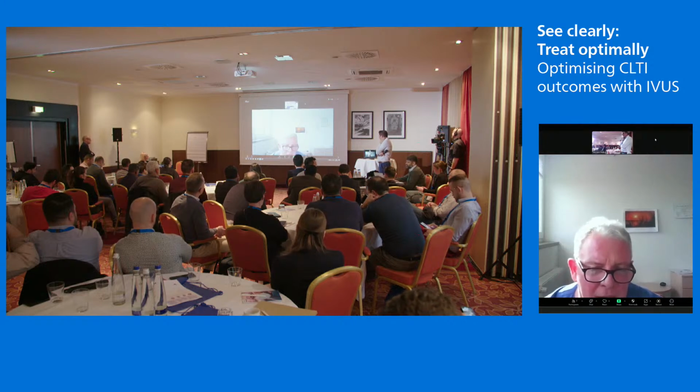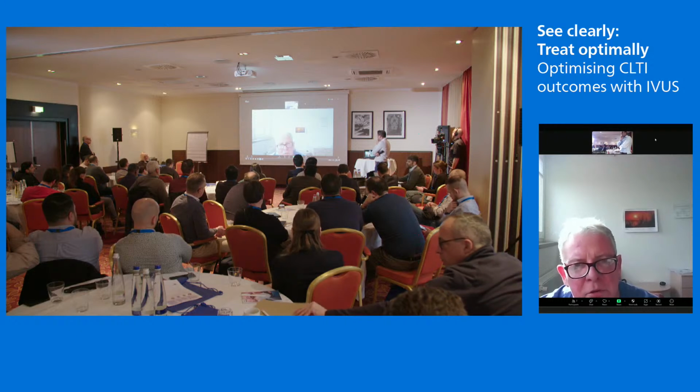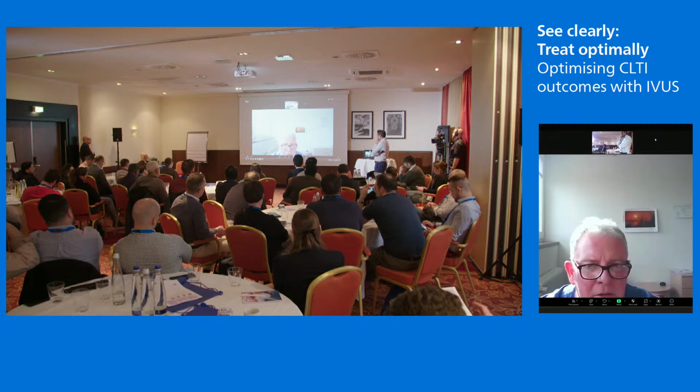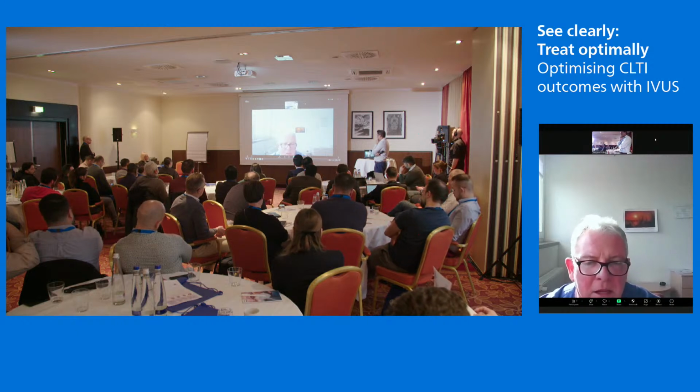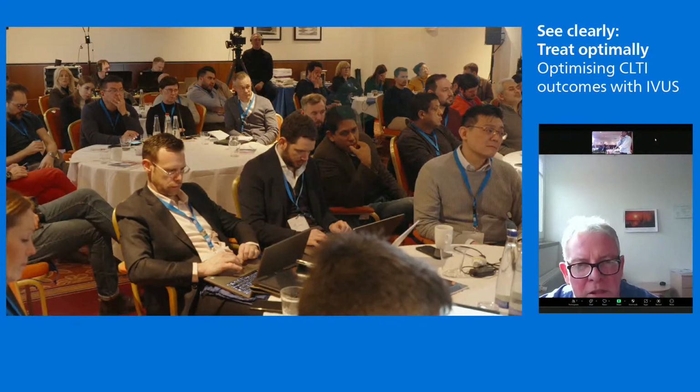So you just lace, you put yourself on top of the cap, maybe with a sheath as well, so that it can't flip away. And then you just lace and you push your wire in, and then you proceed. But then you won't do a debulking. So that's a very, very small channel. And if you get out of the vessel, the bleeding can be stopped by prolonged dilatation. But then still you have got lots of material inside the vessel, then you still need to debulk.